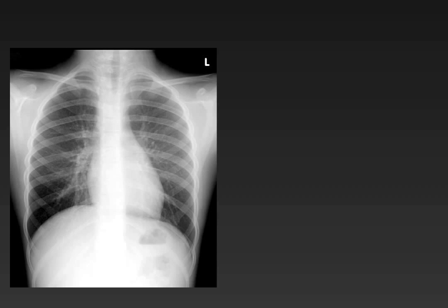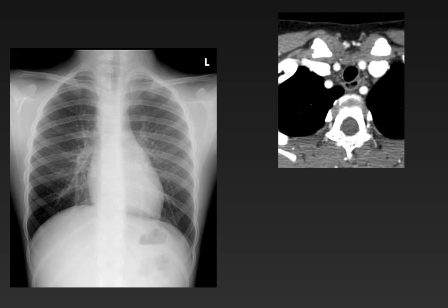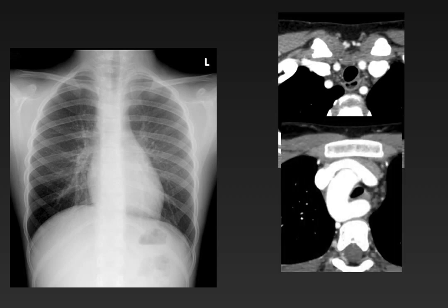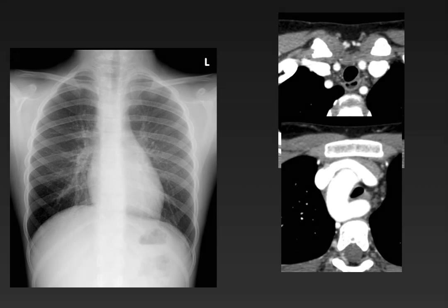Here is a child who presents with wheezing as well. On initial inspection, there is slight asymmetry in lung density, but more importantly, the trachea is not to the right of midline — it is slightly to the left, and the aortic arch is on the right side of the chest. Many children with a right aortic arch who present with stridor will have a vascular ring. On CT scan, we see a normal tracheal diameter above the arch, but a dramatic change in caliber at the level of the aortic arch caused by the aberrant left subclavian artery coursing behind the esophagus.